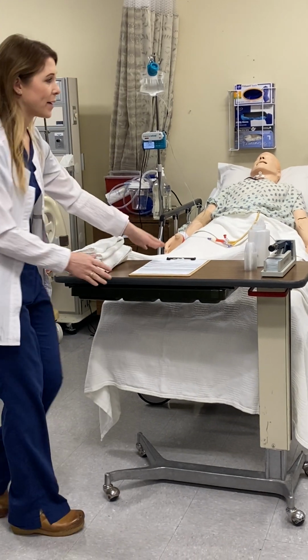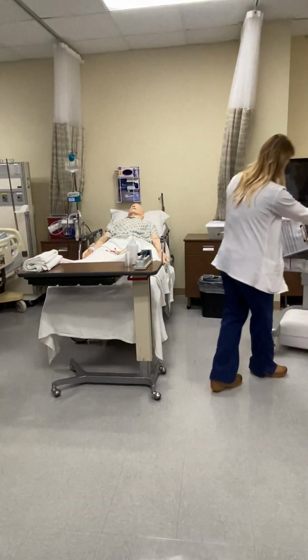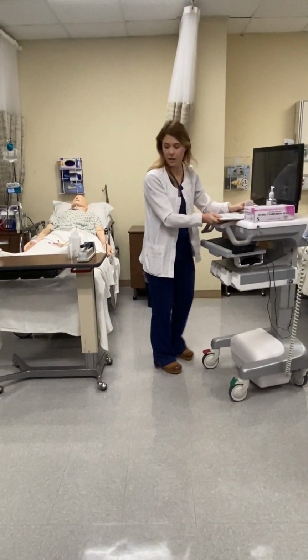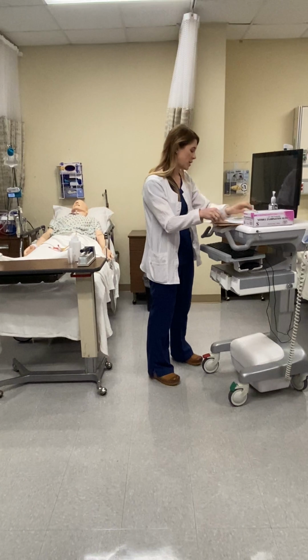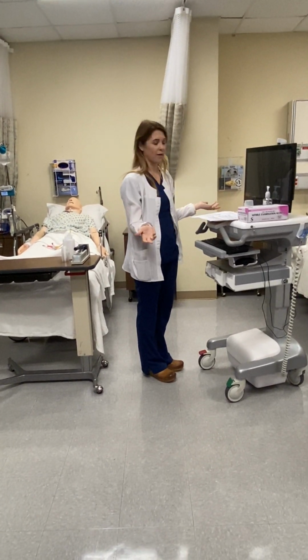So I have my order here. Let me get my stuff together. This is just randomly set up, so hopefully we got all the supplies we need here. Okay, so I'm outside of the patient's room, and as you did in PO Med check off, or you're going to do, we start by comparing our order to our MAR every time.